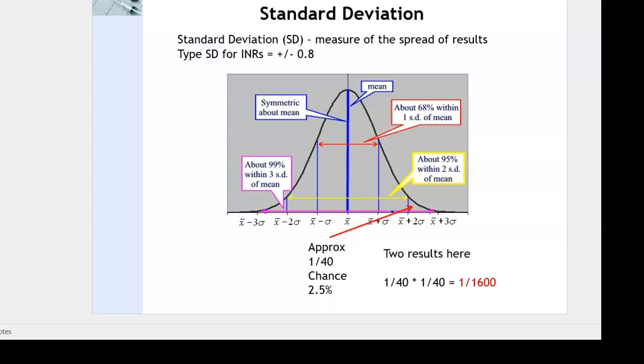Please check your interval settings. If you would like to tighten them up to work like our latest standard ones, let us know. That's a very easy change to make.